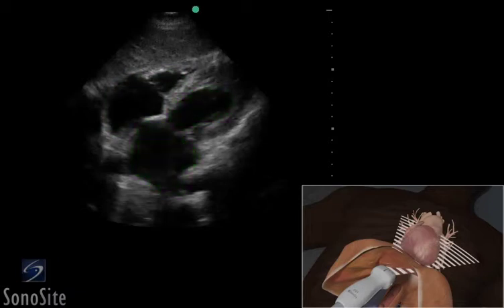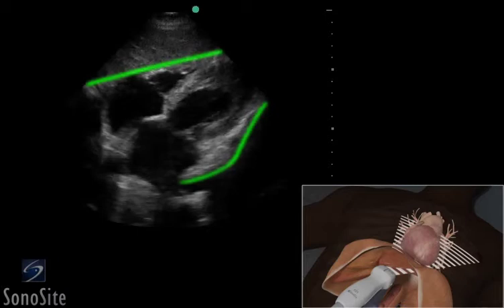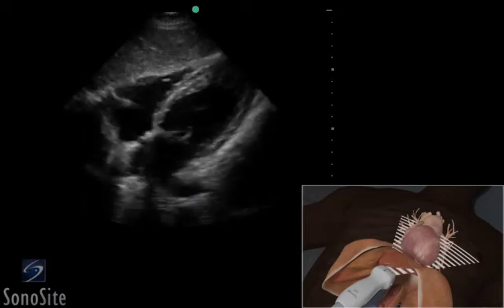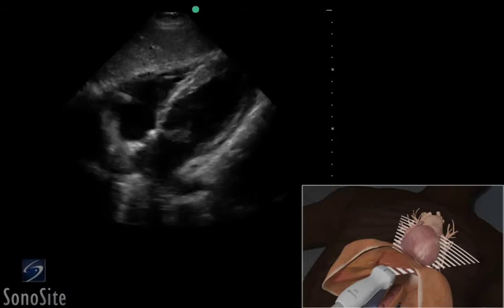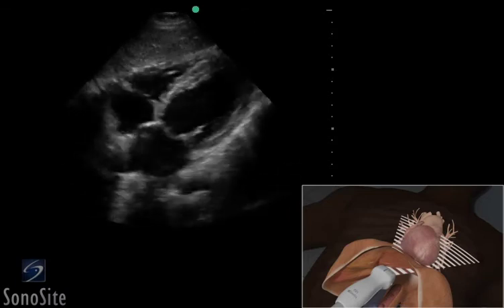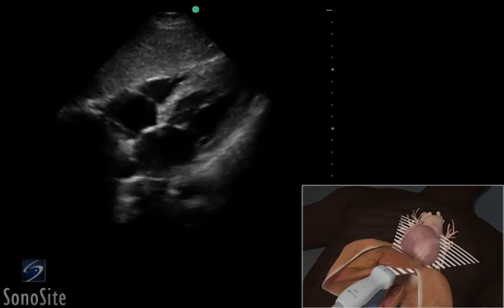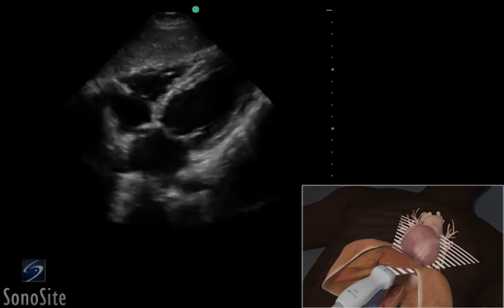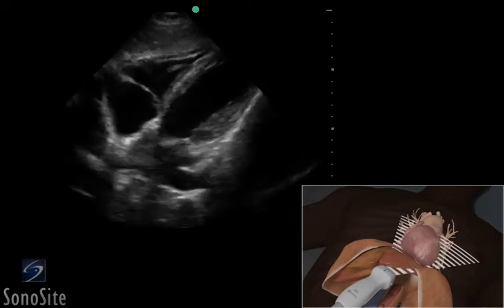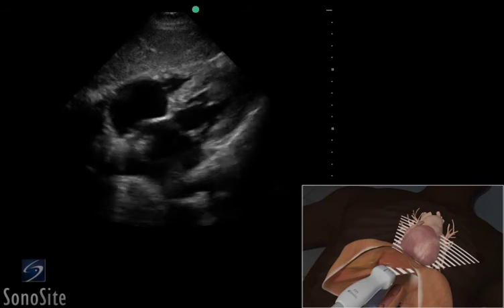The myocardium will appear gray and the blood-filled chambers will appear hypoechoic. The bright white pericardium is seen surrounding the heart adjacent to the gray myocardium. Evaluate the function of all chambers, compare the size of the right and left ventricular cavities, and note any wall motion abnormality and the presence or absence of pericardial effusion.